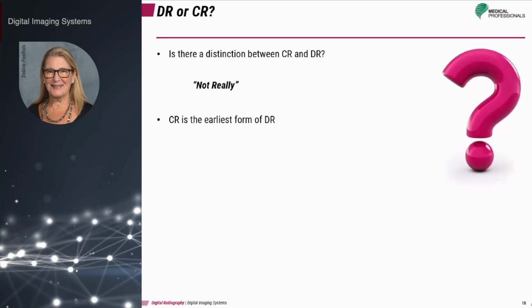Both are digital imaging processes, and the only distinction really is the image receptor that's used in CR, which was, as we said, the earliest form of digital imaging.